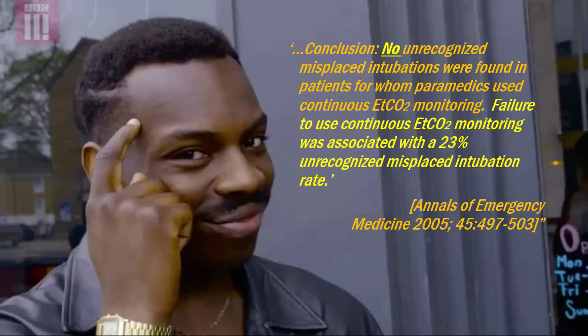So when you think about that, failure to use end-tidal CO2 basically means that the paramedics think they got it, and they listened to lung sounds, they did everything else they're supposed to, but they didn't recognize it as a gut tube. And I'm telling you that this happened all the time before end-tidal CO2 became mainstream. All the time. Competent paramedics, diligent paramedics, experienced paramedics. Even if your first pass success rate was higher than this, it still is never 100%.